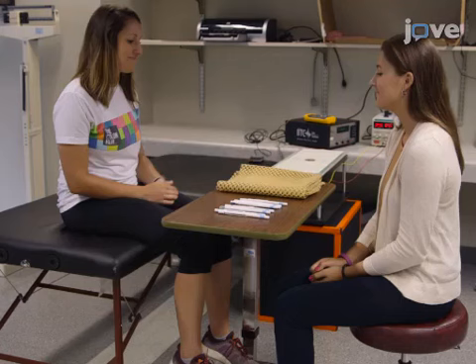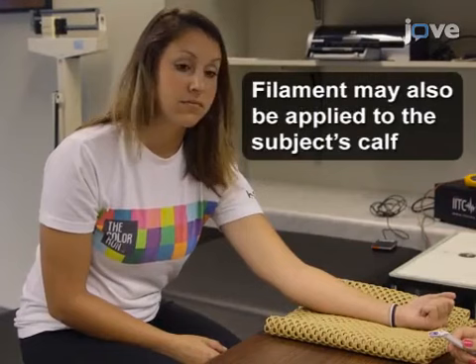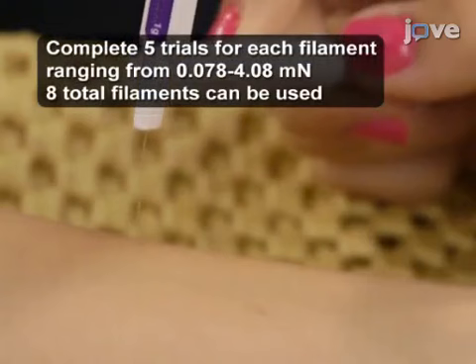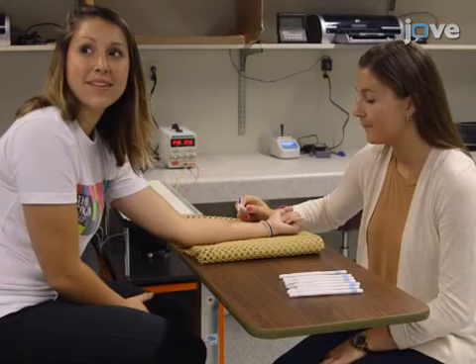Escort the subject into the testing room and have them sit on an exam table that provides arm support. Give the filament to the subject and let them gently bend it against the skin of their hand. During each trial, ask the subject to look away from their forearm. Start by applying the smallest filament at 0.078 millinewtons to the subject's forearm until it bows, and ask if they feel the filament. Complete four positive trials where the filament is applied to the forearm and one randomized negative trial.